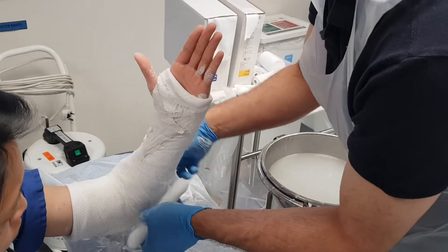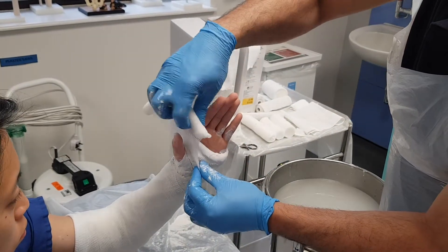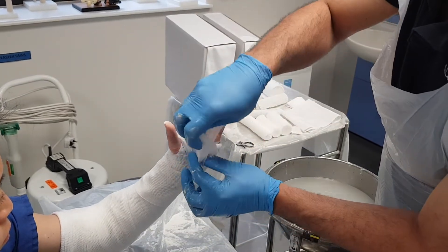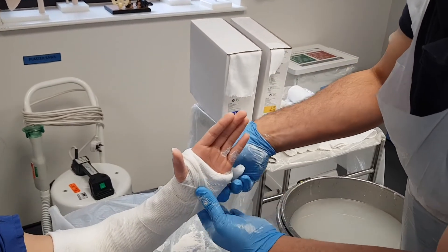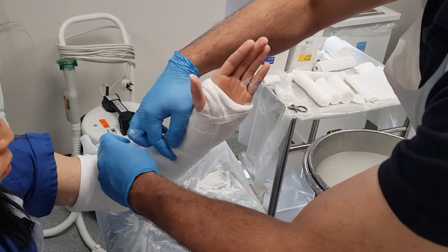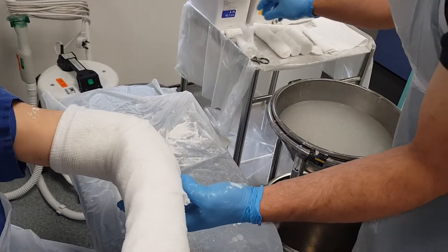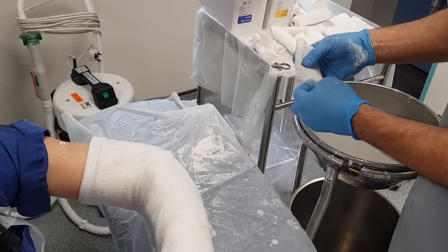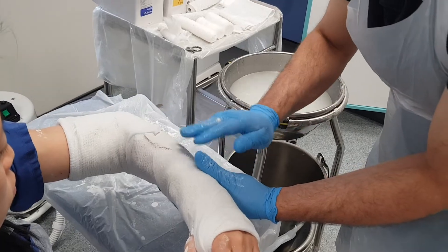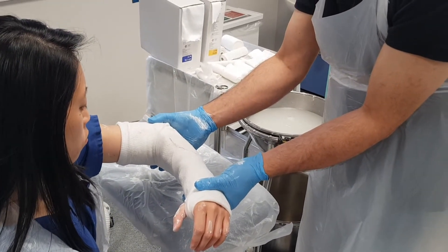I'm going to keep the arm at 90 degrees and twist the bandage as it goes around the thumb so that it doesn't impinge on the thumb at all. When we've got to the ends I can use a piece of plaster to stick this down, smooth it on, and that will glue the end of the crepe bandage down.